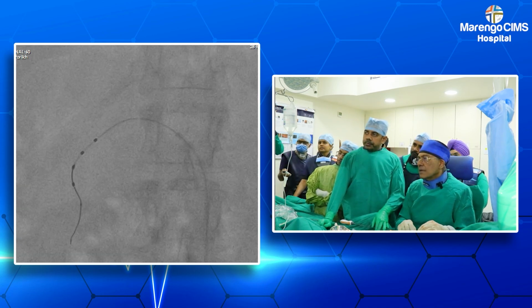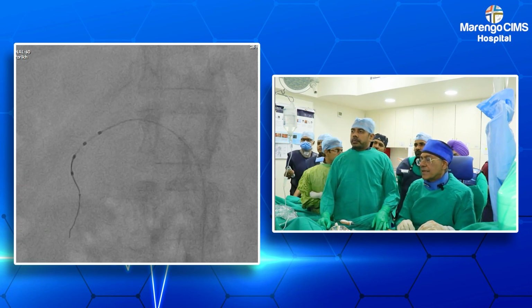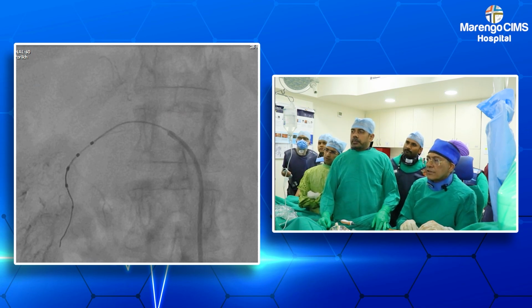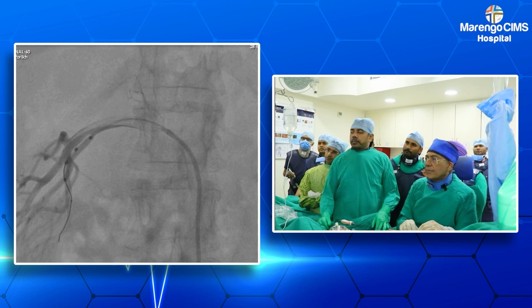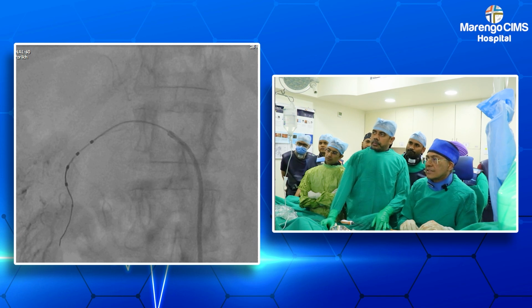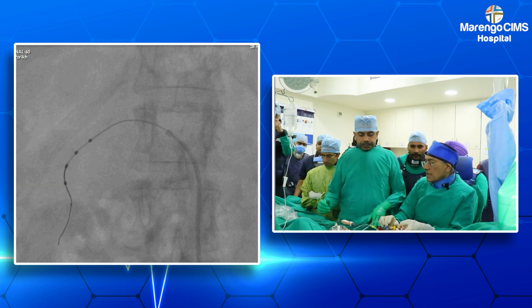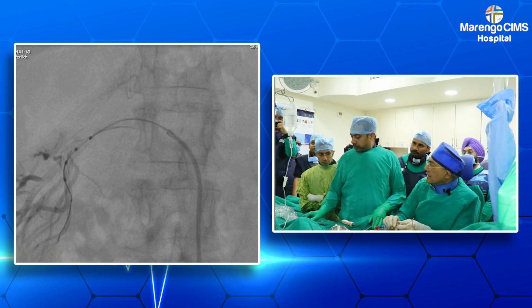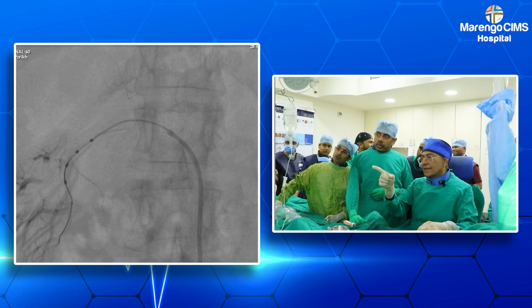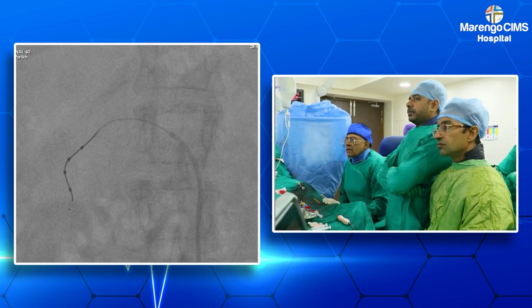So as you see on the run, the artery appears to be around 3 millimeters with some degree of 10-20% variability, and it's a long artery before it reaches the cortex. So we'll be able, I think, to adequately put the entire 2 millimeter of the 4 electrodes and the distal tip inside, where the tip can stay inside before the cortex. Be liberal with the nitroglycerin. Give it liberally whenever the patient is very hypertensive. We can see the cortex. So we can still advance a little bit of the catheter and then we'll pull back.